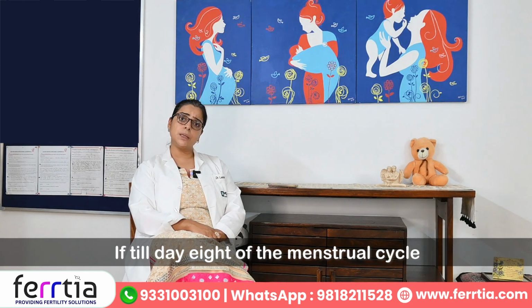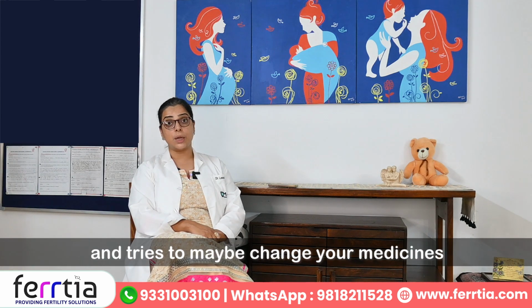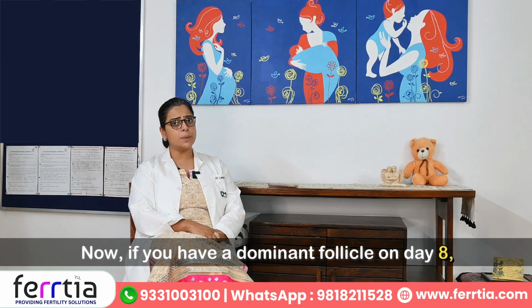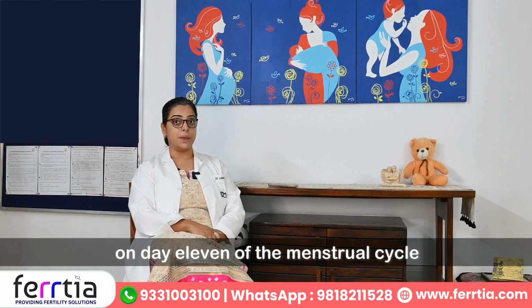If till day 8 of the menstrual cycle you do not have a dominant follicle, then the doctor becomes worried and tries to maybe change your medicines or tries a different protocol. Now, if you have a dominant follicle on day 8, the doctor again tells you to get a repeat scan done on day 11 of the menstrual cycle.